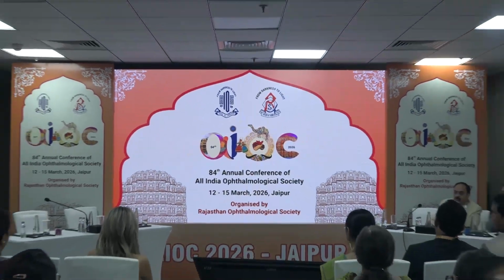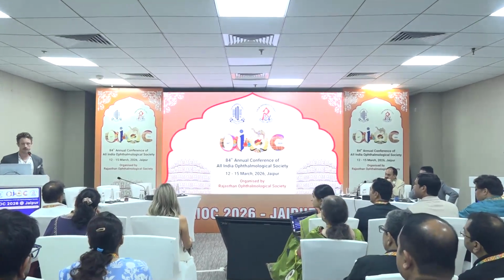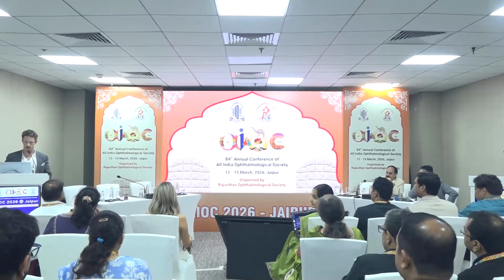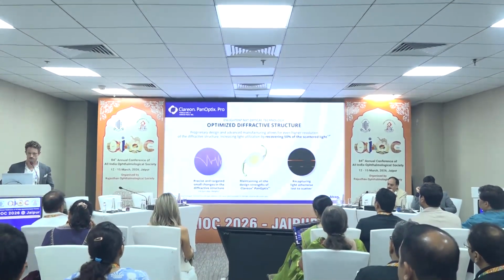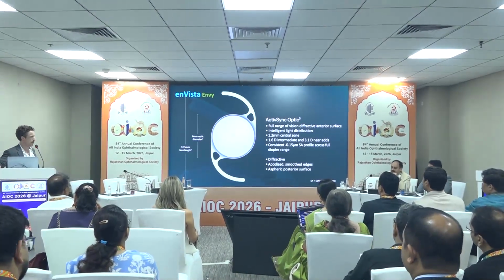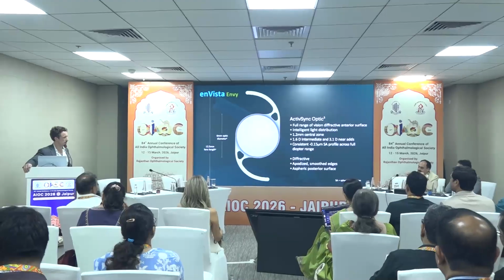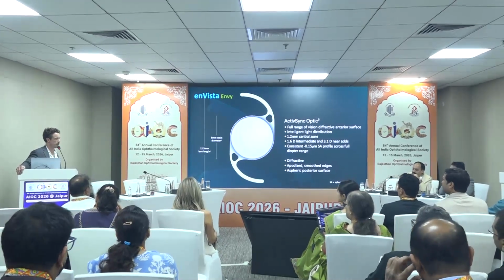Thank you. Very nice talk. I'd just like to ask you one question. What is the central ring size in this lens? I have it right at the beginning. Let me go see if I actually had it written down there. Because what I'm seeing from the slides, it's just my subjective observation, the central ring is slightly larger than the other lenses. Yes, that is actually true. So 1.2 millimeter central zone.